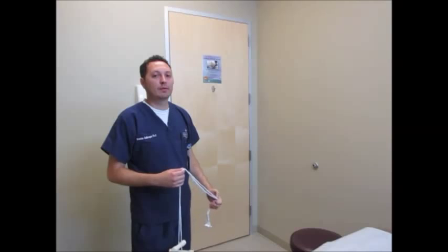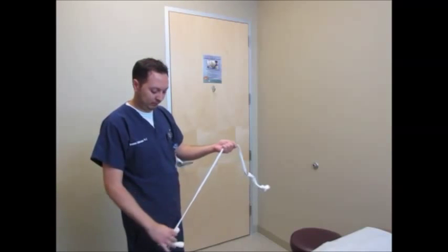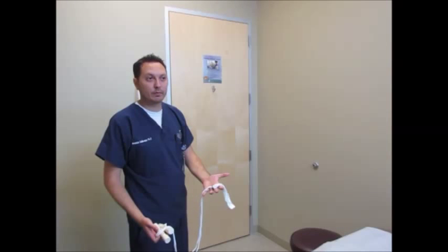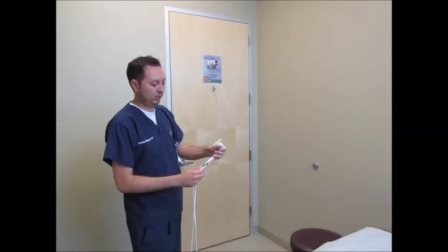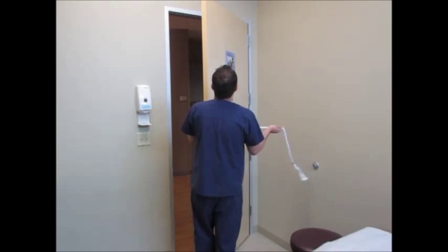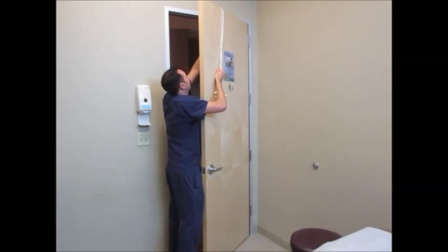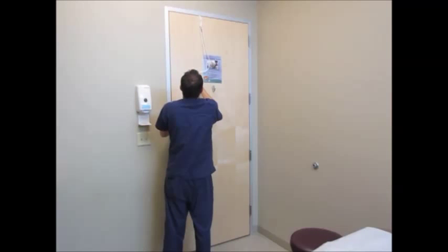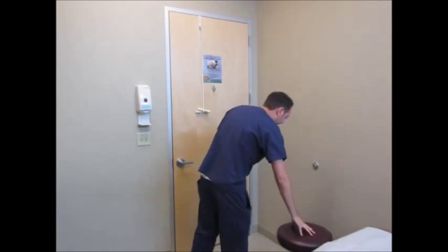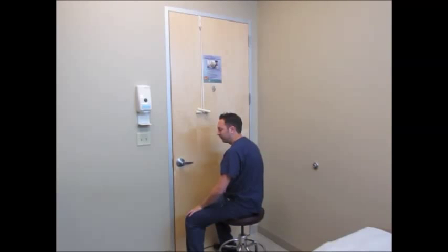The next exercise is also a passive exercise — a passive forward flexion exercise. We call it the rope and pulley exercise, and it's included in your therapy kit, or you can get it separately from the physical therapy department. It's a little pulley with an attachment meant to get hooked over the door. The only trick is making sure you get the pulley to come on the outside of the door.